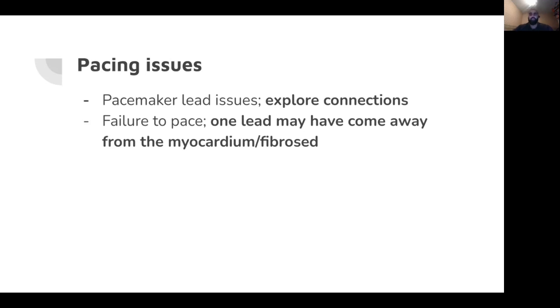Sometimes you can feed both of the wires that are coming out through the chest through a needle, pass it through the skin, and then connect it to the pacing box. If only one of the 2 leads has broken, then that will create a circuit between the lead that's still attached to the heart and your skin, which is perfectly fine as well. It's similar to transcutaneous pacing, but it would require lower amounts of energy.